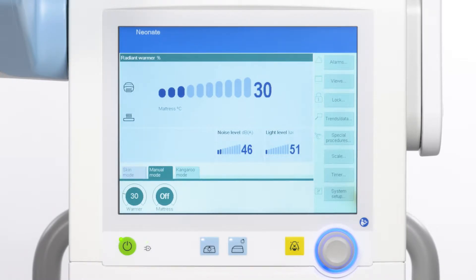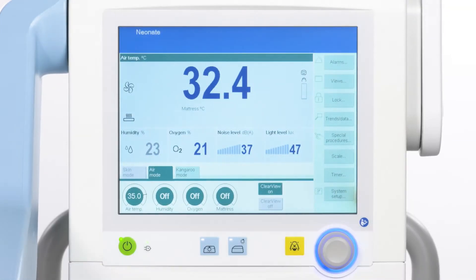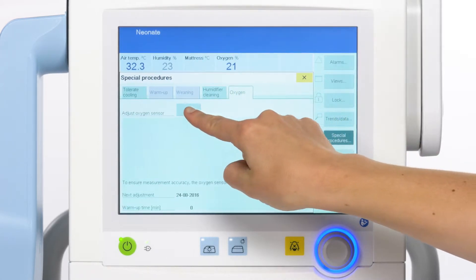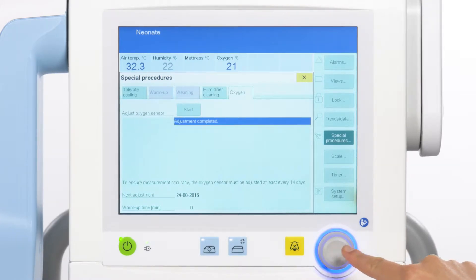Open the hood and the side access panels for at least 3 minutes. Close them after airing. Touch Special Procedures, open the oxygen tab and then press Start to activate the oxygen adjustment. An info text will appear when the oxygen adjustment has been successfully completed.